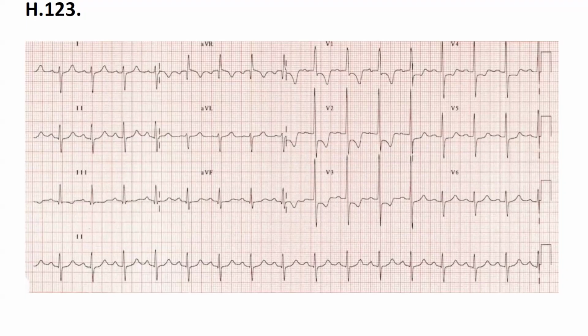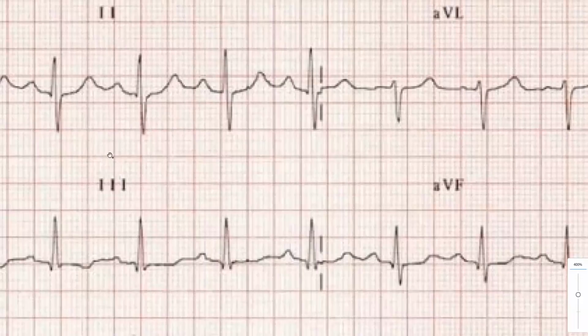And the morphology of the P waves. Normal? Yeah, but there's some changes. Actually, no, it's fine. Sorry.